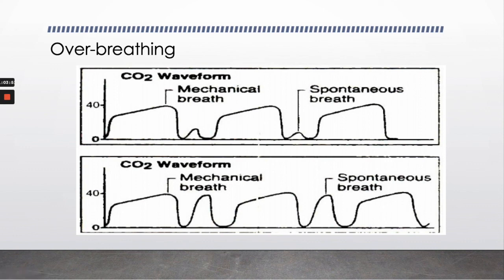Sometimes this can happen if you're letting them wake up and you're trying to get them to rebreathe, if you still have the ventilator on. So if you have decreased the rate, maybe you were ventilating them at a rate of 10 or 12 and you decreased it to 6, a lot of us will decrease the rate to 6 or sometimes even 4 to let that CO2 climb to stimulate them breathing as the muscle relaxants have worn off. Then you start to see them take breaths, and you see these small spontaneous breaths in between the ventilator breaths, and then they get bigger as they become stronger.